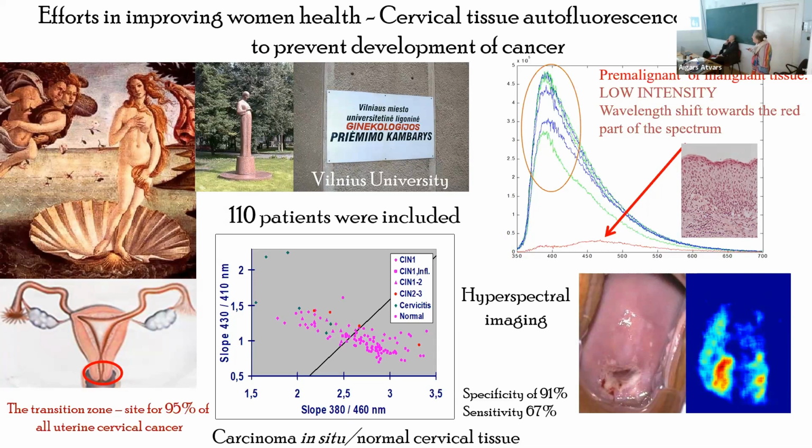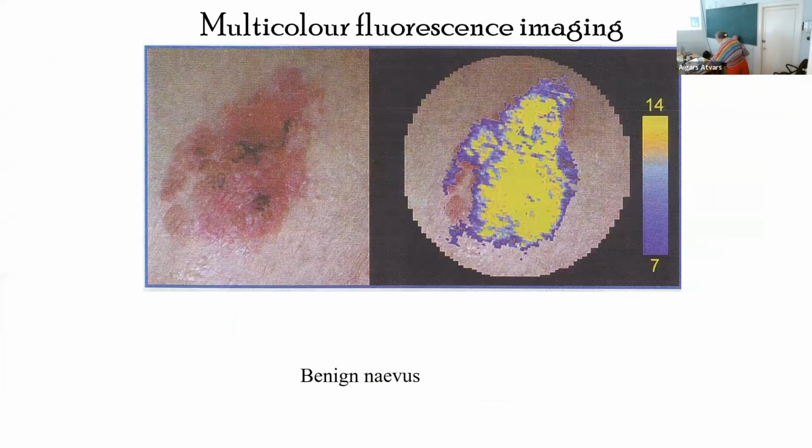And you see on this side, we can imagine that there is something wrong, and that is also shown brilliantly here in fluorescence. But on the other side, we see exactly the same fluorescence signal, but absolutely nothing by the naked eye. So this shows how selective this technique can be, so we can visualize cancer that is not visible by the naked eye. And that is, of course, quite promising.